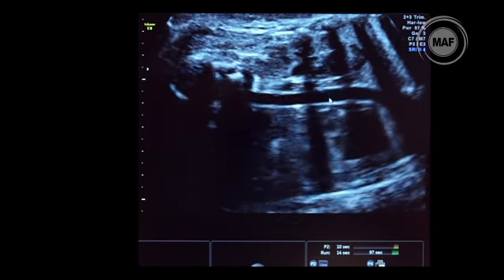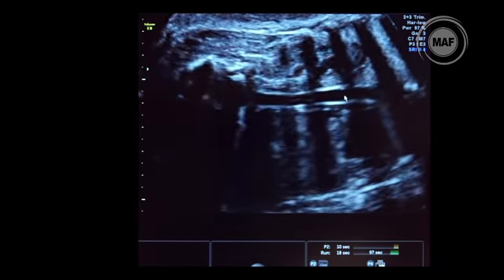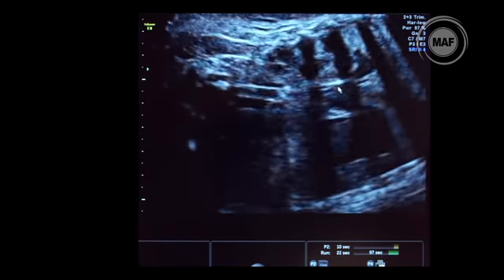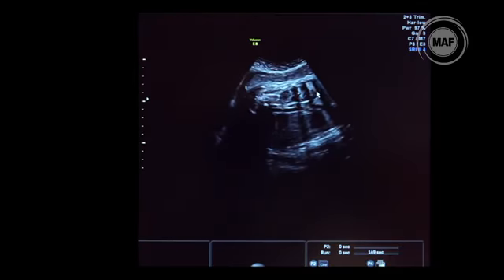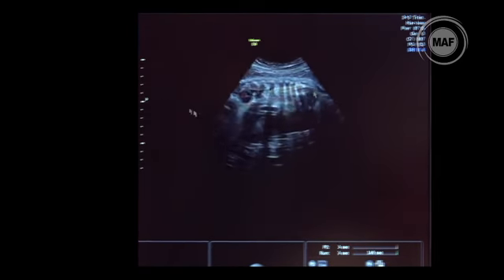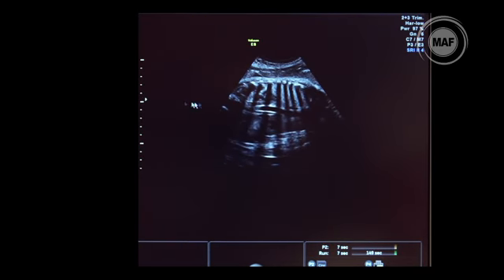Okay, and that's the main blood vessel that goes through all our bodies, called the aorta. You can see it pulsating there. See that? Right? Okay, so you can see if you scan at this stage, you can't see much. This little triangle there, you see that? That's a focus. So it should be more or less in the middle of the area you're scanning.